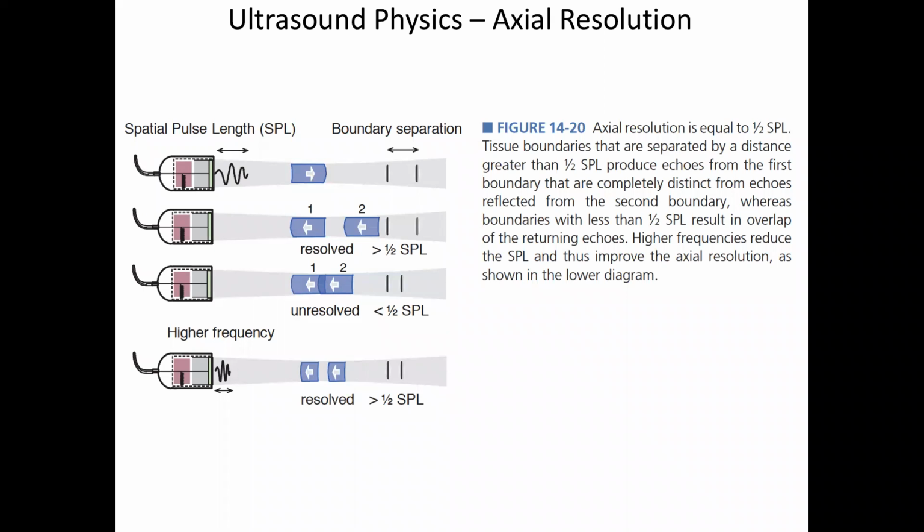And the problem is, at that frequency, the decay of the power of the wave you're putting in is very short, right? So you won't get any depth penetration. You won't see anything beyond, say, a few centimeters if you go up to 20 megahertz. At 2 megahertz, you're going to get to 10, 15 centimeters into this sample, right? So there's a balance.